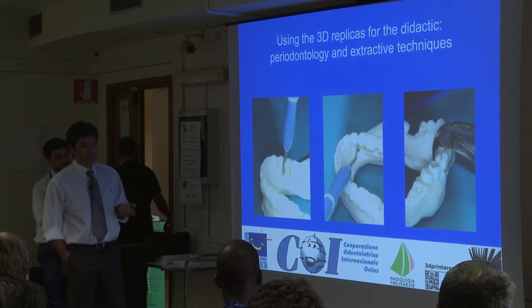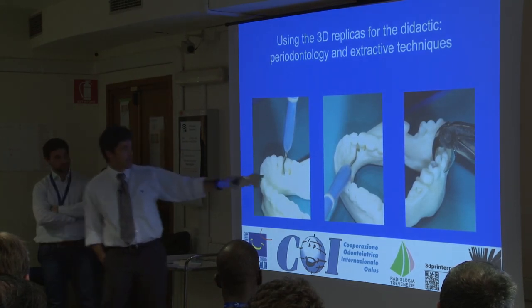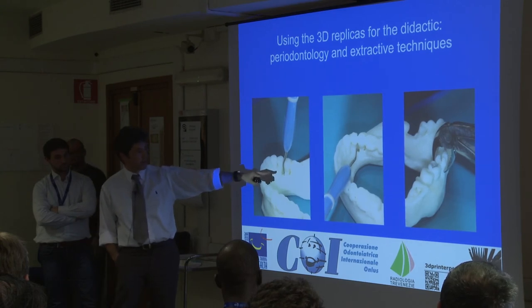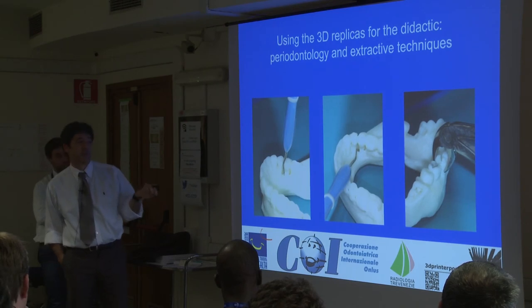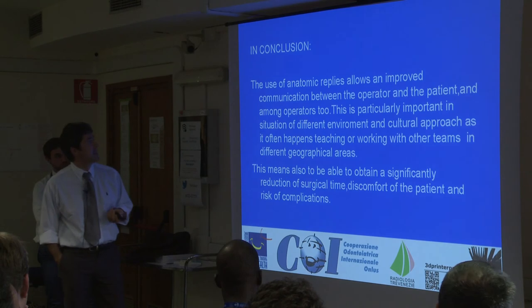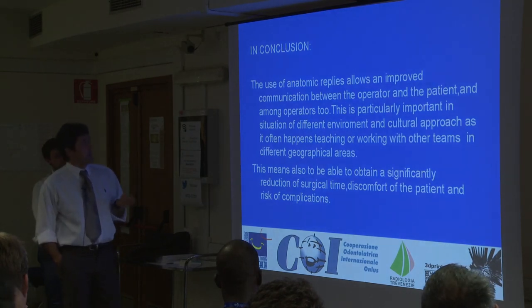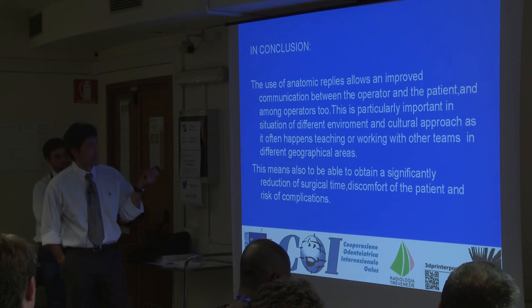In periodontology, I can teach the colleague to reach the tartar, the calculus, in a deep pocket, or, more simply, to choose the right forceps to remove a lower premolar. So, in conclusion, the use of anatomic replicas allows an improved communication between the operator and the patient, and also among the operators.